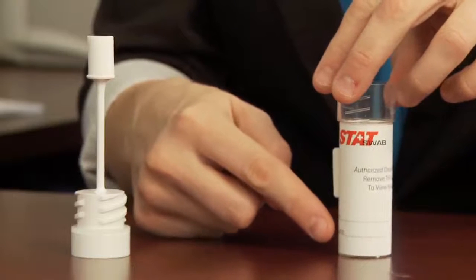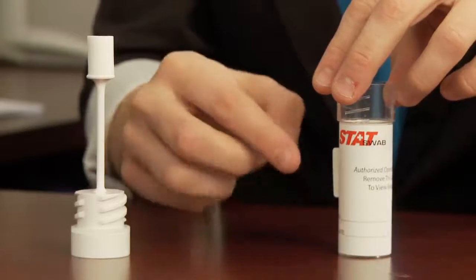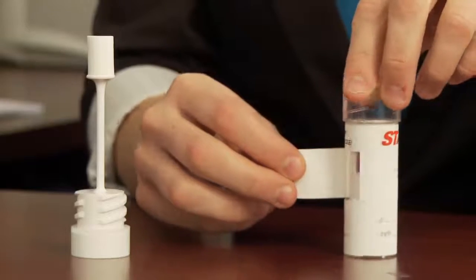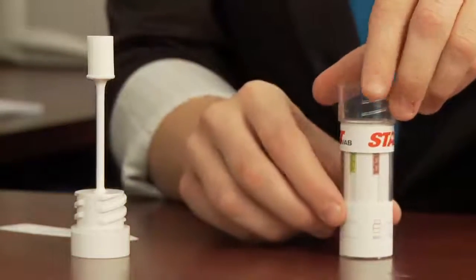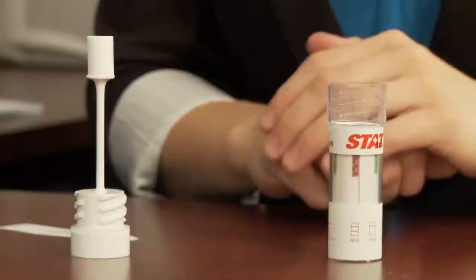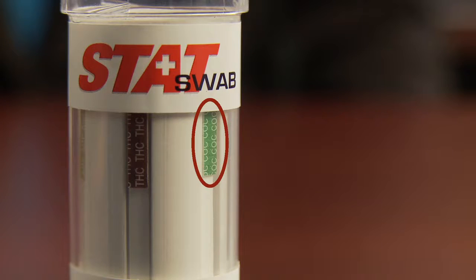The StatSwab also includes a perforated removable label that allows the administrator to view the test results. Test strips should be visible in the test window, where test result lines will appear for interpretation. Each strip is also labeled with the abbreviation for the corresponding drug that it will indicate for.